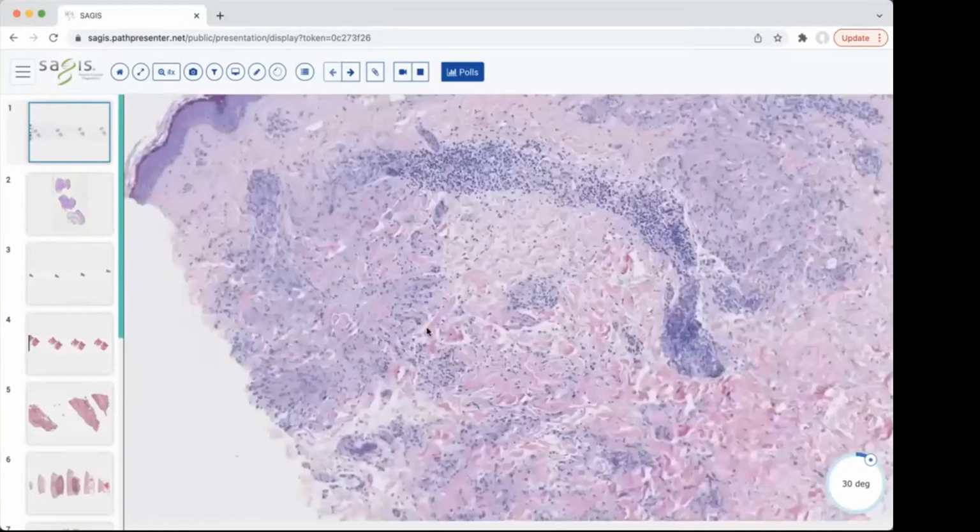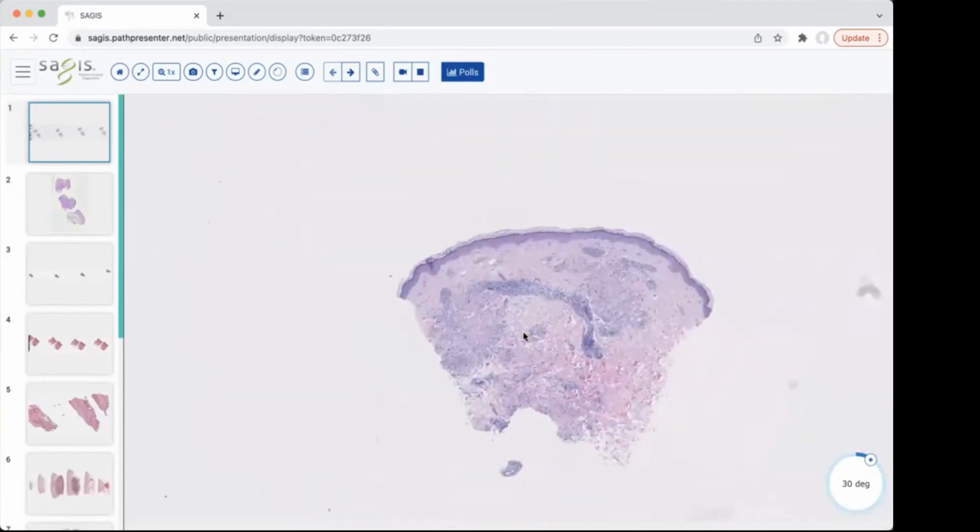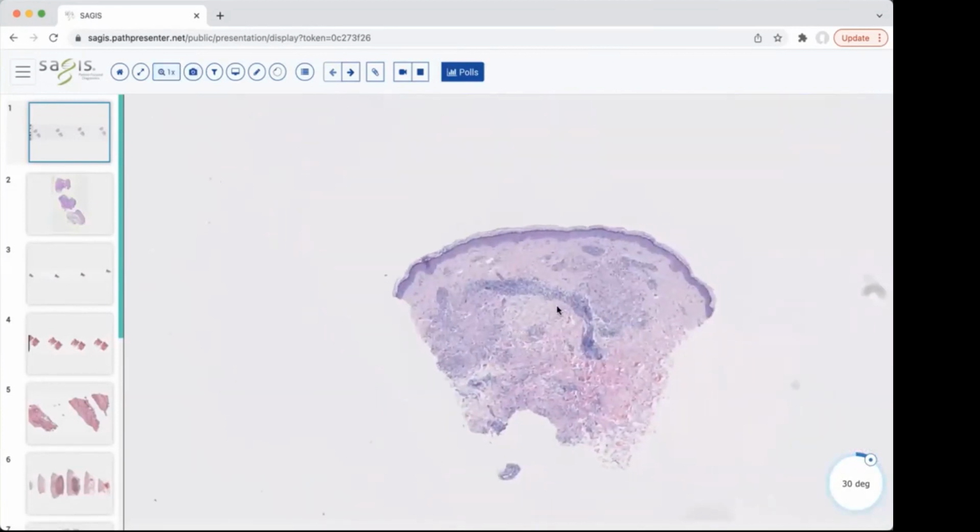And so we'll go in at a little bit higher power here and notice that the histiocytes are sort of fenced around this collection in the dermis of degenerating collagen, and it's stained a little bit with a blue or kind of gray hue, and that's mucin. And so this is classic granuloma annulare. I think noticing that there's the palisade at the low power is important. You can even get it here on the 1x.